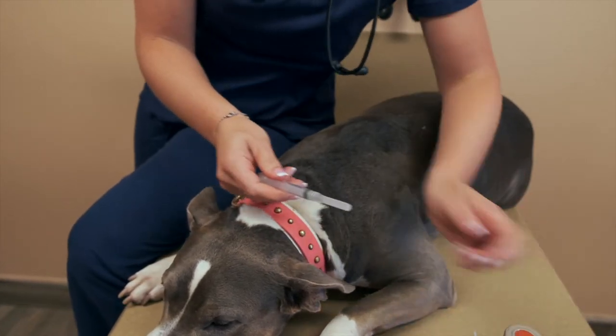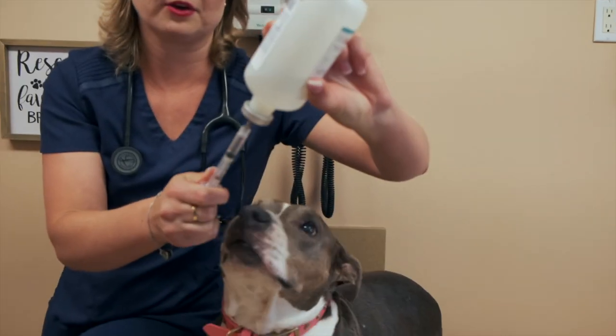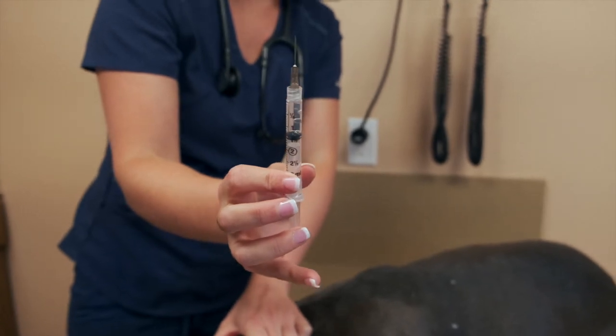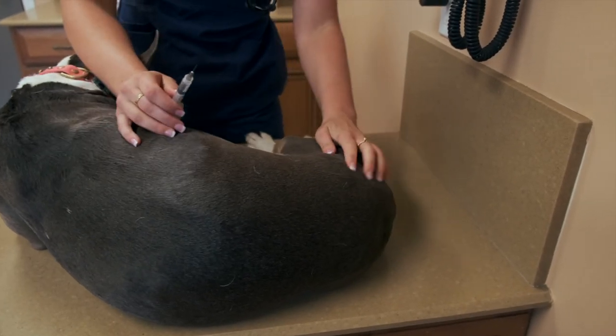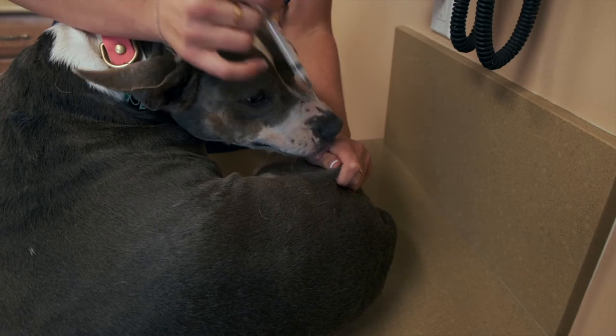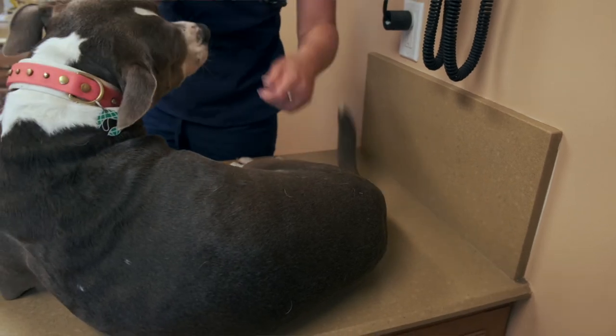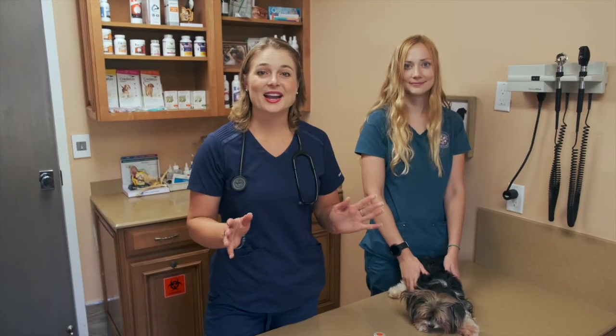For the sake of this video, I'm going to give Bella one more shot in her butt using some sterile saline. I'm drawing that up with a bigger, more intimidating needle. I go over to her gluteal region, pinch a little bit, and inject firmly and deliberately. She flinched slightly but that's it. I didn't draw back on any of these injections because in the areas I gave them there are no big veins. The skin is lifted away from any veins or arteries, which are too deep to hit anyway.